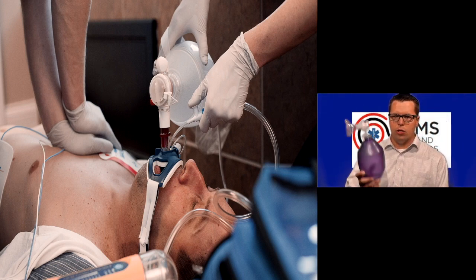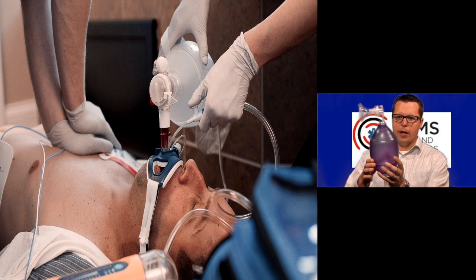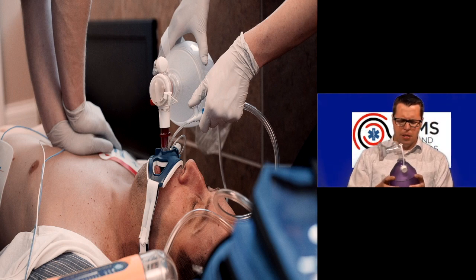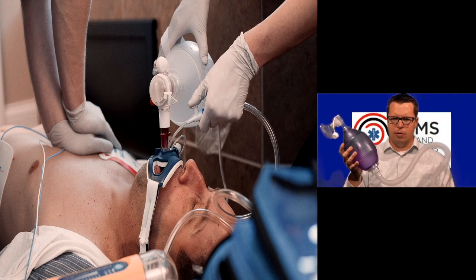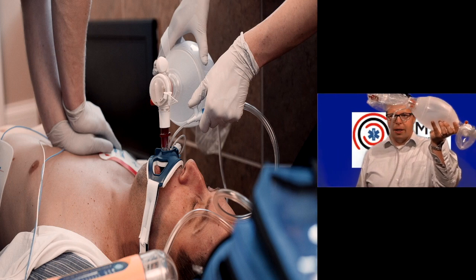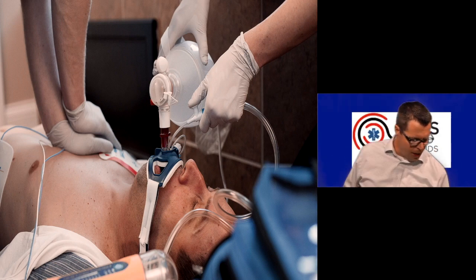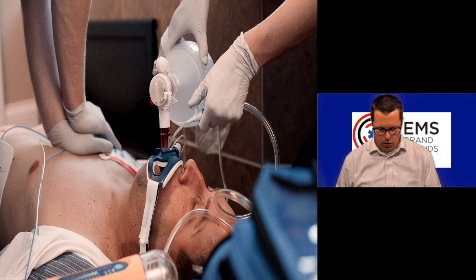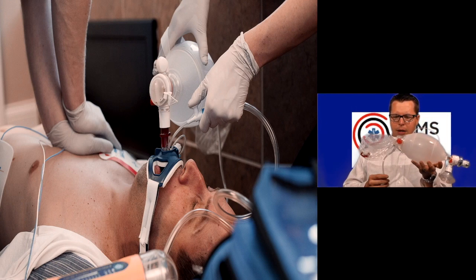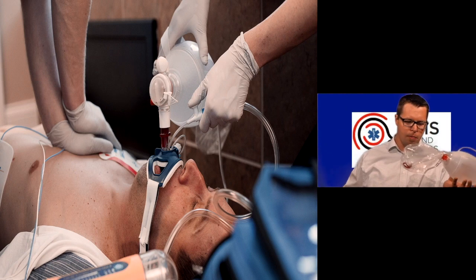So you have your standard self-inflating bag, and this is only self-inflating bags, not the green thing like the Mapleson that you might sometimes see. This is the standard EMS self-inflating bag. Maybe you have a model that looks like this, maybe a model that looks something like this. They all basically function the same, but you've got to talk about the anatomy of it real fast. The easier way to go is with this standard one. What you've got is oxygen tubing that connects up to your oxygen source, whatever it is.